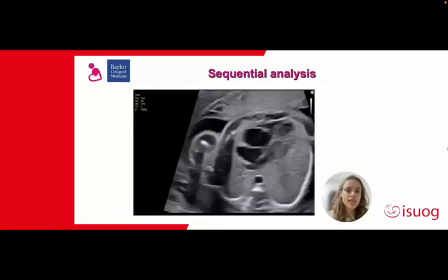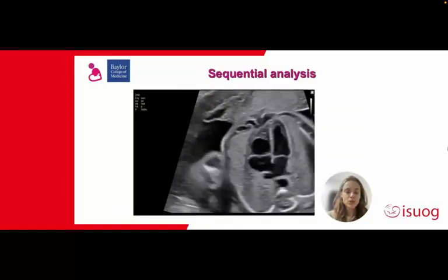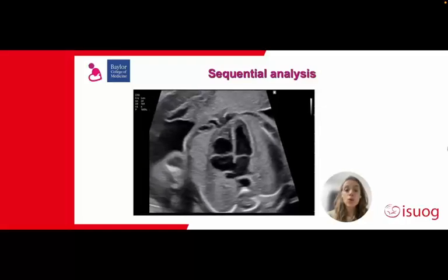But to start with, I will say that we may use the previous tool that I was talking about also for the most complex view. First, we can label each single structure of the heart. We will just need to freeze our image, press the labeling button, and everything will come documented.